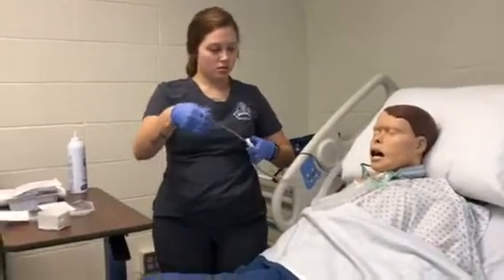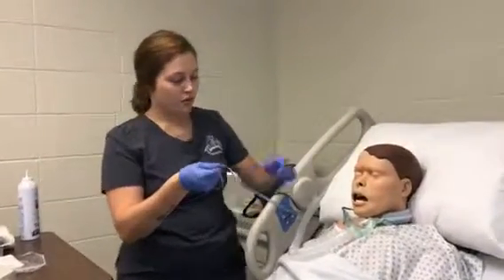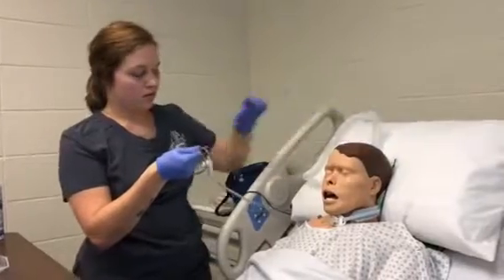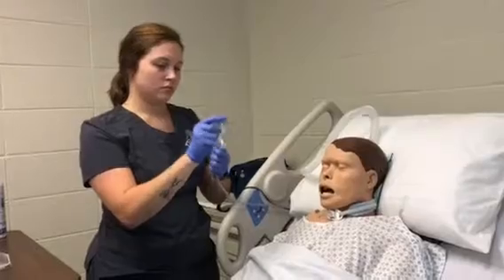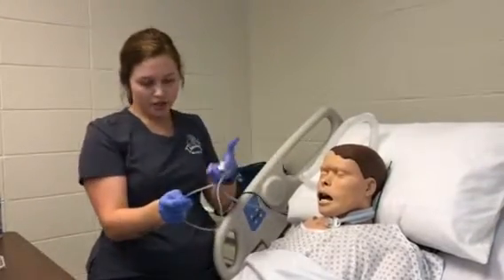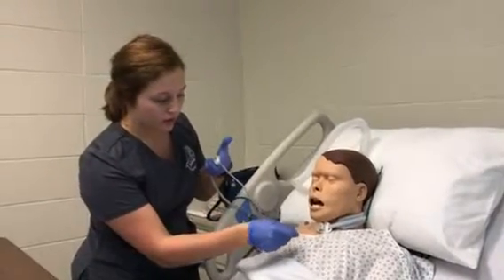And now I'm going to move the oxygen away. We are going to insert this in. We want to make sure that we're not sucking anything while we're going in.